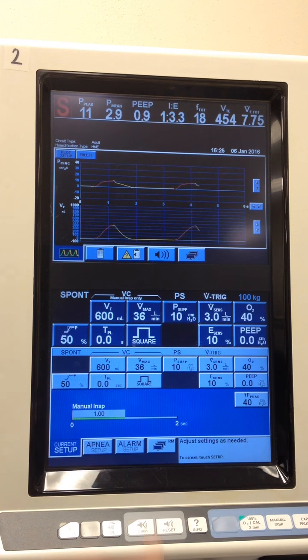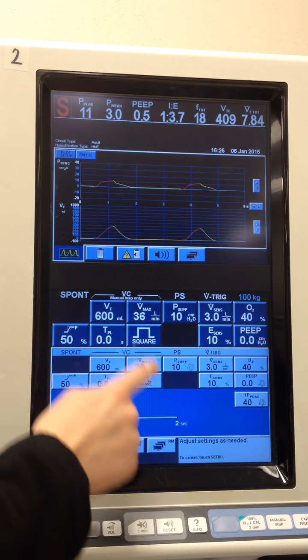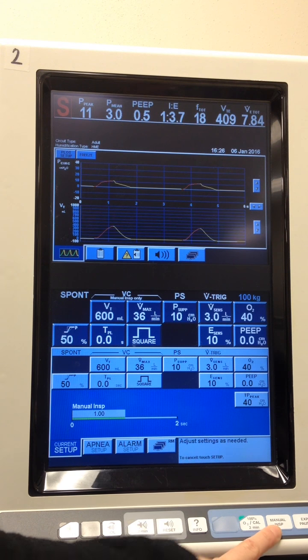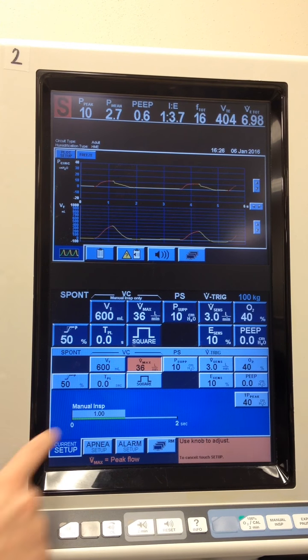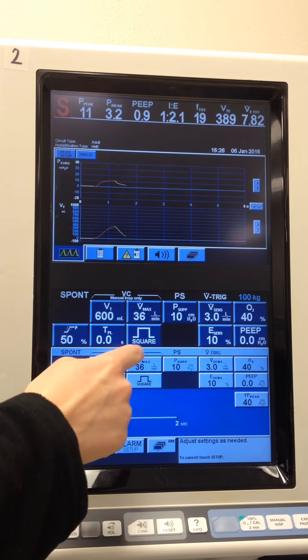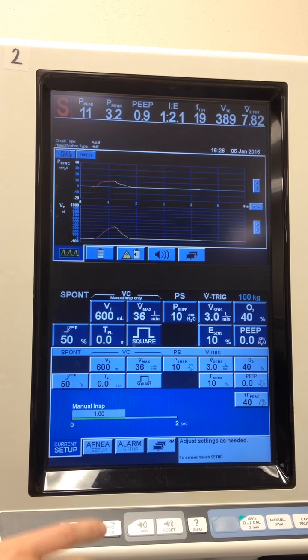Now this pressure support, you saw how we adjusted it last time to titrate our tidal volumes. We're going to do that this time for a 5'6" female. So her ideal body weight we can calculate, and it's about 61 kilos. So if we're going to achieve 10 mils per kilogram on her, we're looking at a tidal volume of around 600. So on these mandatory breaths or manual inspiration breaths, we can set our backup to 600, our flow to about a 1 second I time, and that's there if we need it. So let's go ahead and accept these.